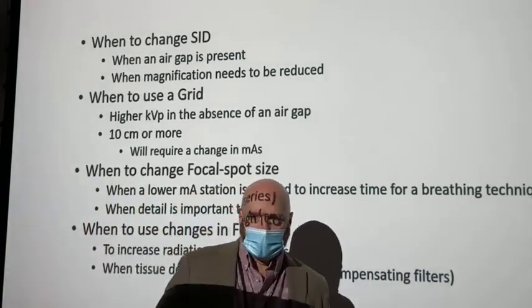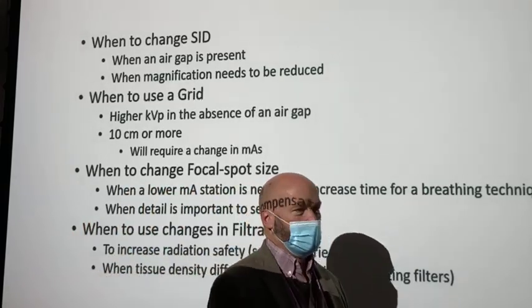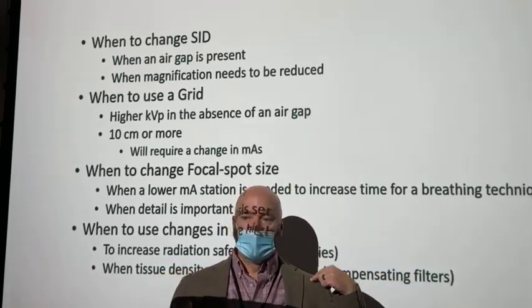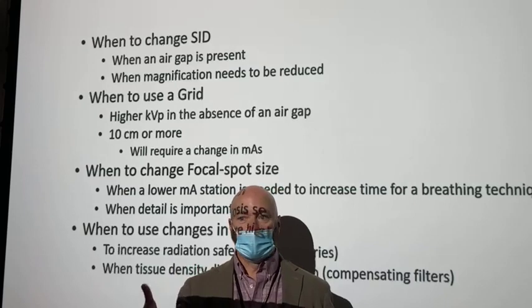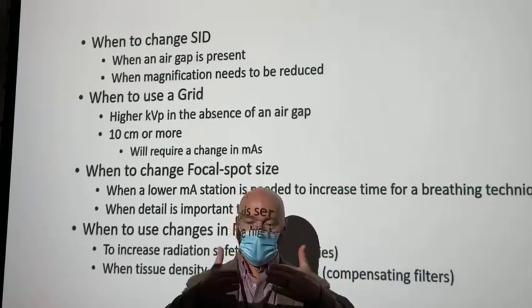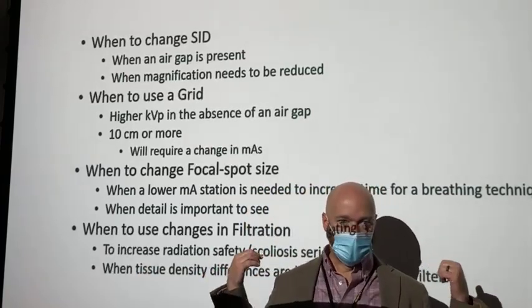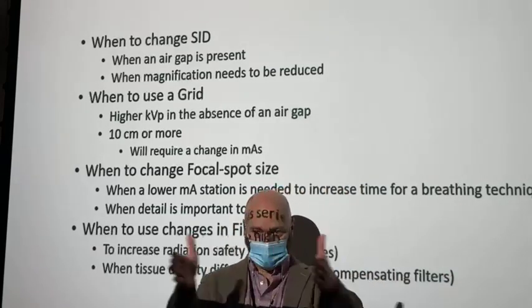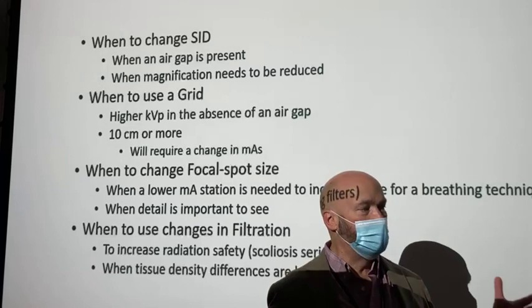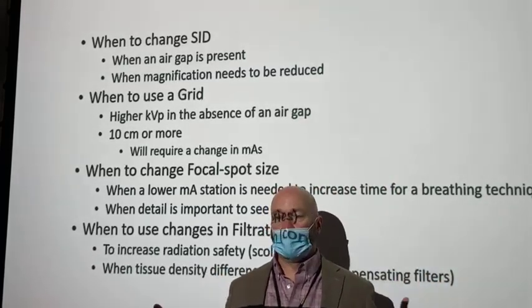What I mean by that is, anybody shot any AC joints yet? Pretty rare. AC joints are acromioclavicular joints. And textbook says shoot them at 40 inches, but I'm telling you, if you've got a patient with any kind of width at all, because of the divergence of the central ray, you're not going to get the AC joints on a 14 inch wide image. 17 by 17 maybe, but a 14 inch wide, you're never going to get them. 17 is even going to be dicey.